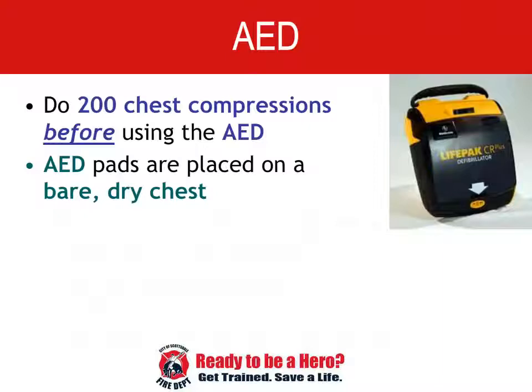If you are just doing compressions, the shirt can stay on, but the AED pads have to go on skin, so at that point you need to remove the shirt. There are scissors in the AED packet. If the victim is a woman with a bra that has underwires, that has to be removed to prevent electrical arcing. If it is a man and he has a hairy chest, there is usually a dry razor in the packet. Shave a spot on the right shoulder and under the left rib to get a good connection with the pads.